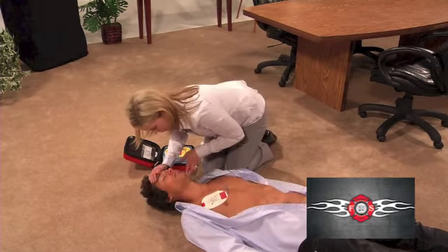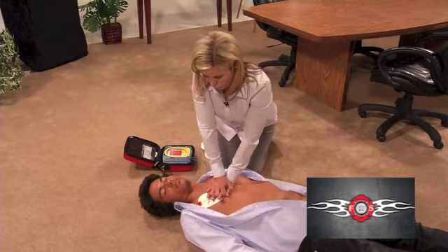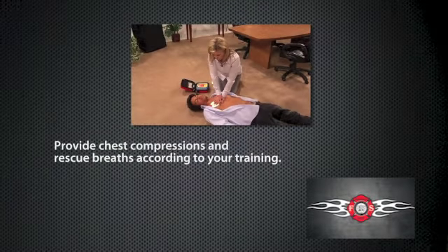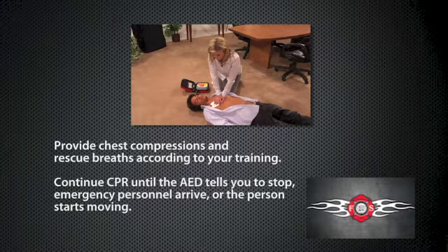Pinch nose, tilt head, and give 2 full breaths. Breathe. Breathe. Continue with compressions. Provide chest compressions and rescue breaths according to your training. Continue CPR until the AED tells you to stop, emergency medical personnel arrive, or the person starts moving.